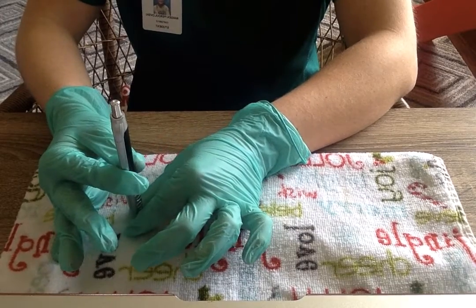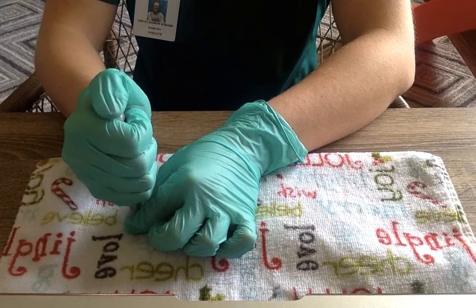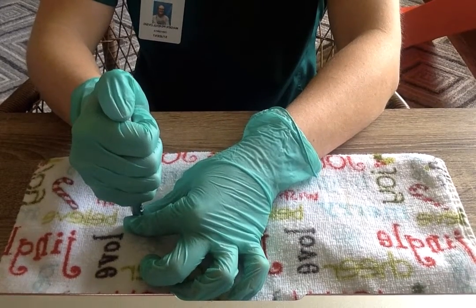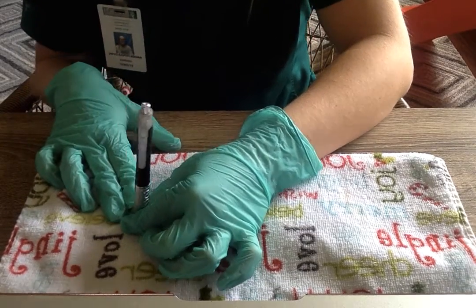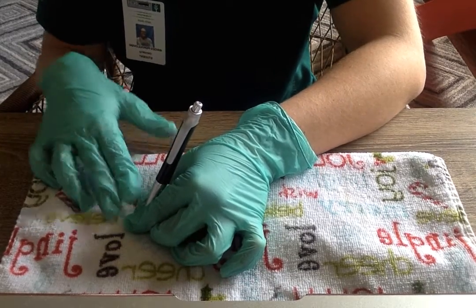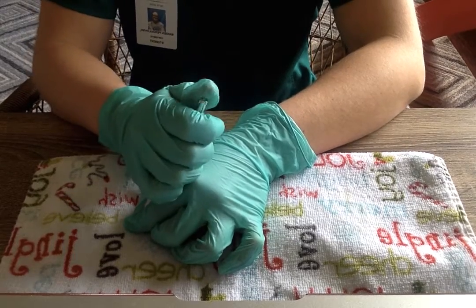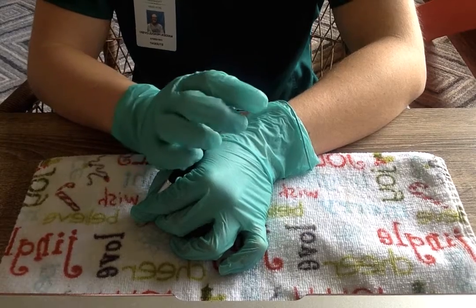And then you want to insert and then secure. Inject, and while this is all going on, you really want to make sure that that needle is secure. And then for the intramuscular injections, you really want to aspirate for 5 to 10 seconds to make sure that you didn't hit, it's not an intravenous, you don't want any blood in there, so that's why you would aspirate for 5 to 10 seconds.